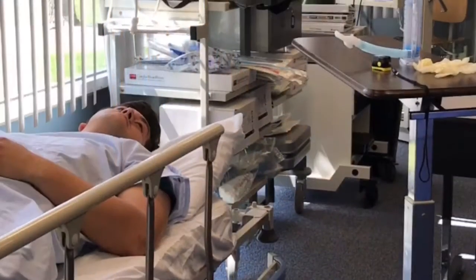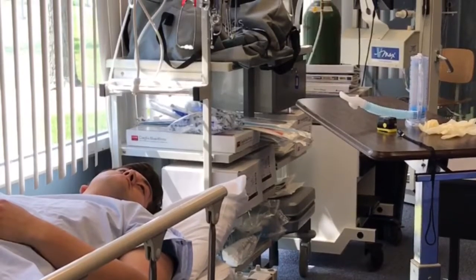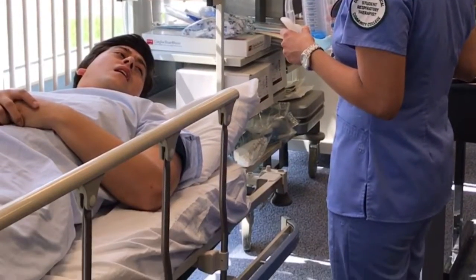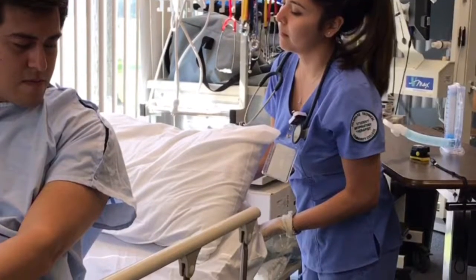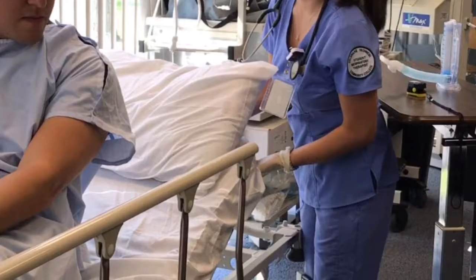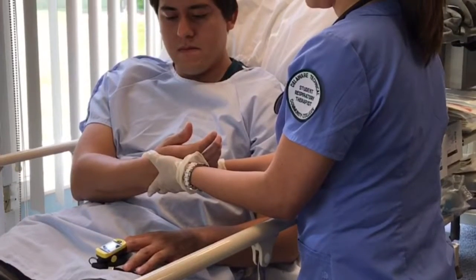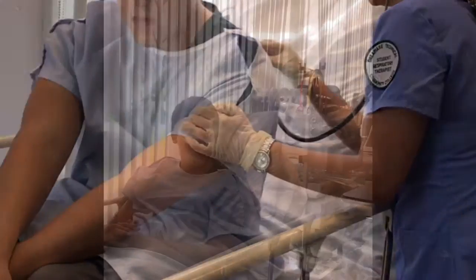We will now see an example of how IS therapy would be explained and performed with a patient. Please keep in mind that you should have already gathered all of your equipment and used 2 patient identifiers. You should have also washed your hands, put on gloves, and positioned the patient correctly. Semi-Fowler's would be ideal. Prior to IS administration, it is important to assess and chart your patient's vitals, breathing pattern, and listen to their breath sounds.